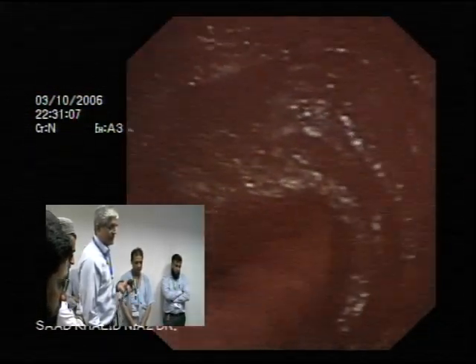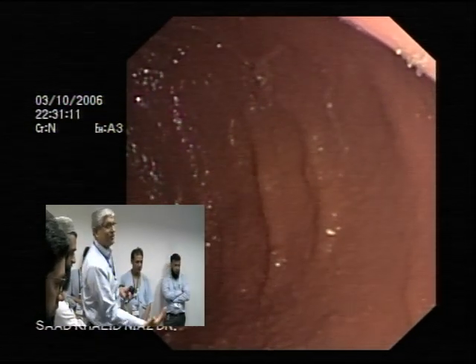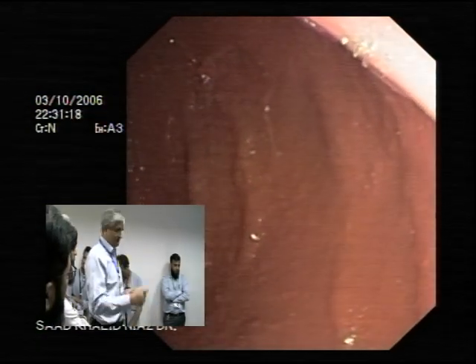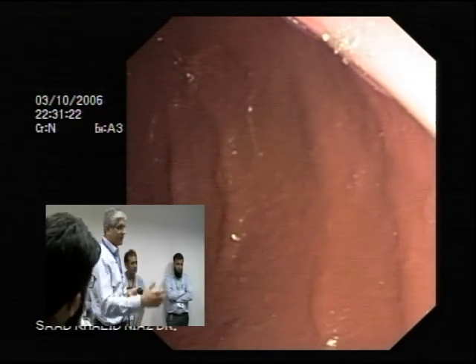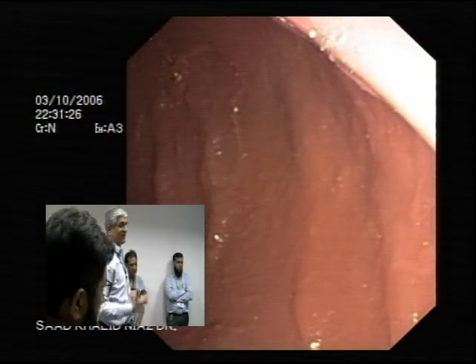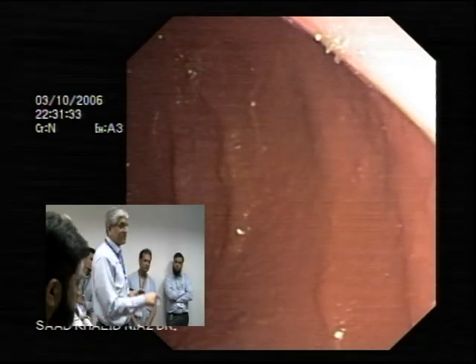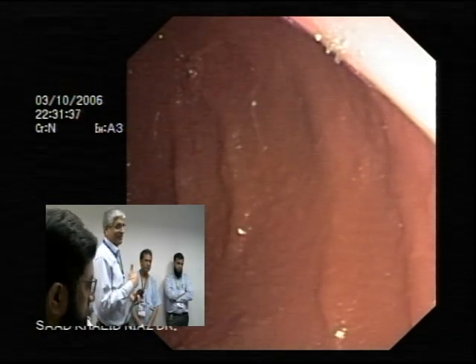What happens is quite often you've seen people keep going, and then you turn back and you've got a big loop and you start hurting the patient. One of the reasons why conscious sedation is a problem with these is because you've gone to the stomach, you're in that rush, you keep going and you've created a big stretch in the stomach. The moment that stretch occurs, the patient becomes uncomfortable. The reason is not that the patient is intolerant, the patient is our fault.